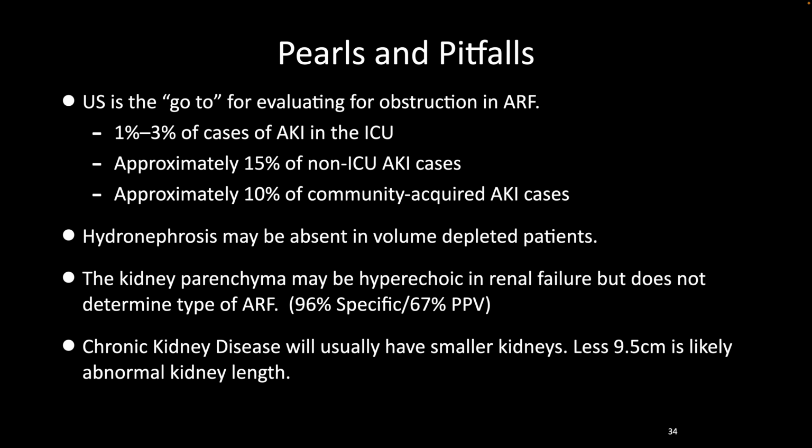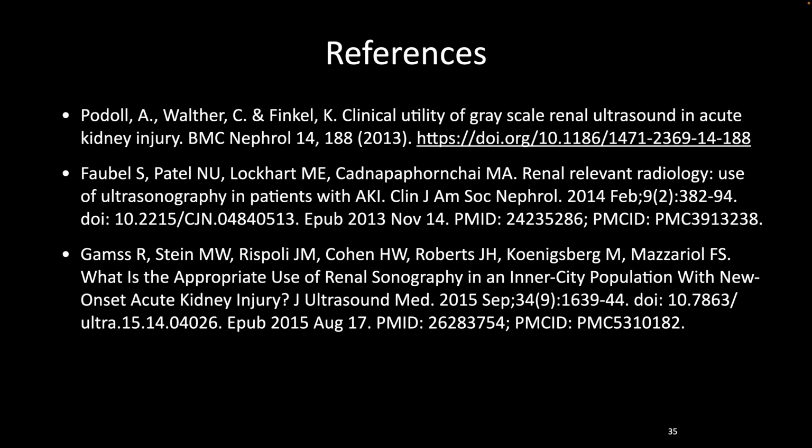Now, the overall volume of the kidney is important, but again, that may be beyond the scope of clinical ultrasound at the bedside and may require further tests, but that is one thing that we could recognize, that the kidney length is not normal. Keep in mind that the normal kidney length is typically between 10 to 12 centimeters in most individuals.